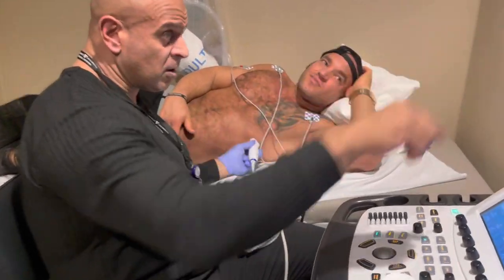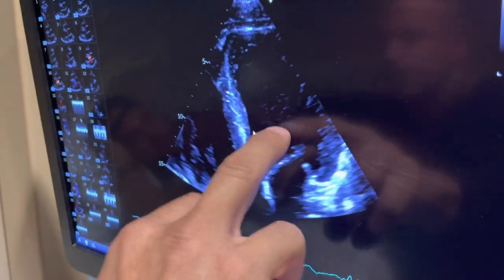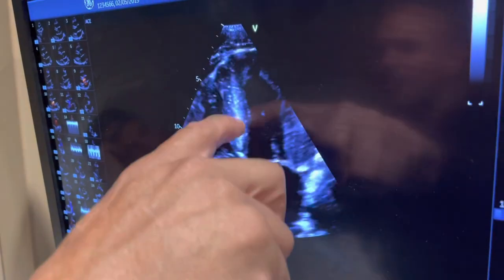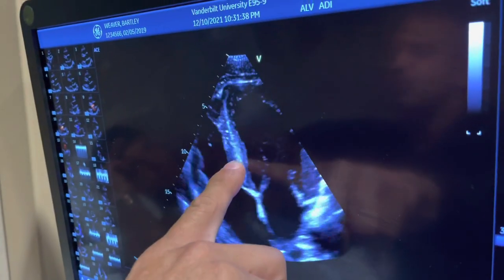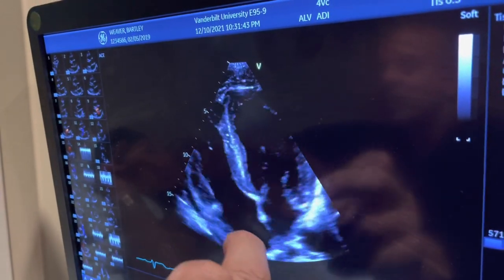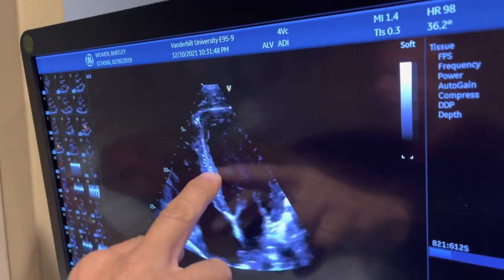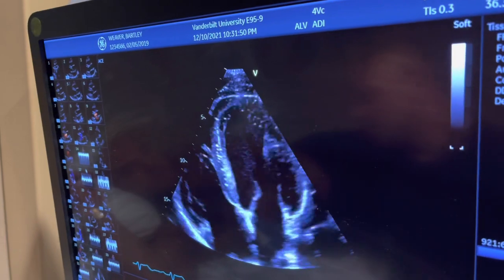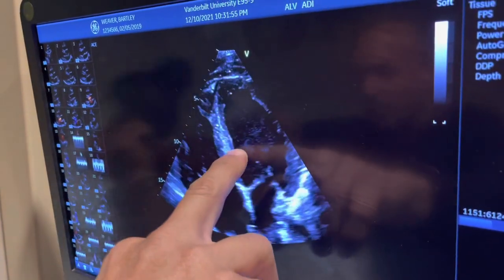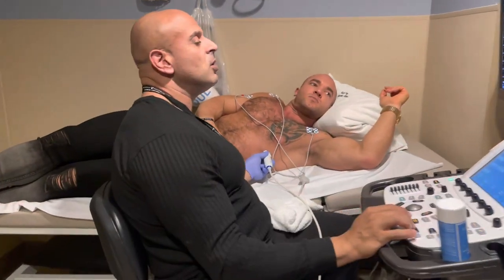Now we're seeing the entire heart. Beautiful function — see how well it squeezes. This is your left ventricle — the main pumping chamber. That's the ventricular septum — the IVS — right between the two ventricles. We just measured it. The heavier you lift over the years, that muscle gets thicker. You can actually control it with blood pressure medicine.